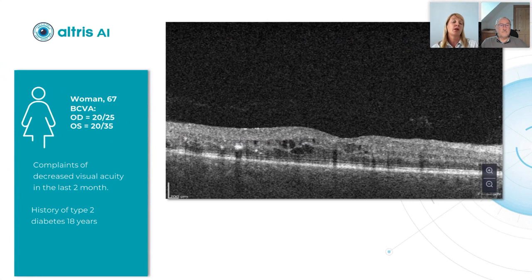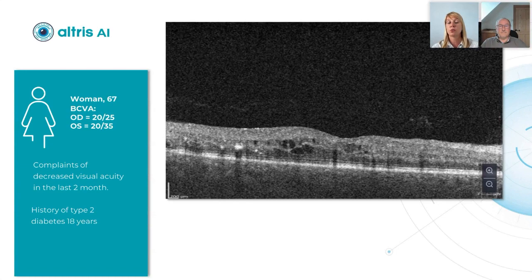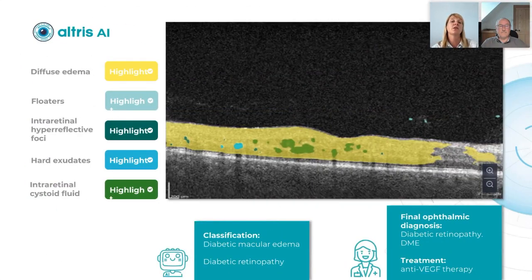One more case: a 67-year-old woman with complaints of decreased visual acuity during the last two months. She had a history of type 2 diabetes for 18 years. You can see that the retina is damaged from her OCT exam. Biomarkers detected included diffuse edema, floaters, intraretinal hyperreflective foci, and hard exudates.